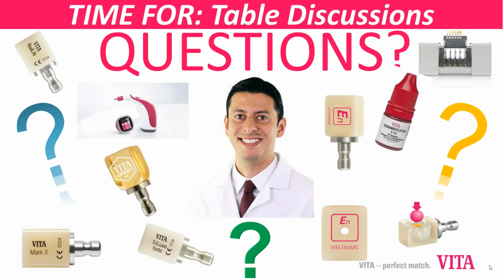We have a question from William. On Ambria, do you only bond, or do you also conventionally cement? Yeah, that's a great question, William, because it's a clinical reality. Maybe you're working on a posterior tooth that has one of the proximal surfaces slightly subgingival, and it's very complicated to create an ideal rubber dam isolation, and then conventional cementation would make a lot of sense.